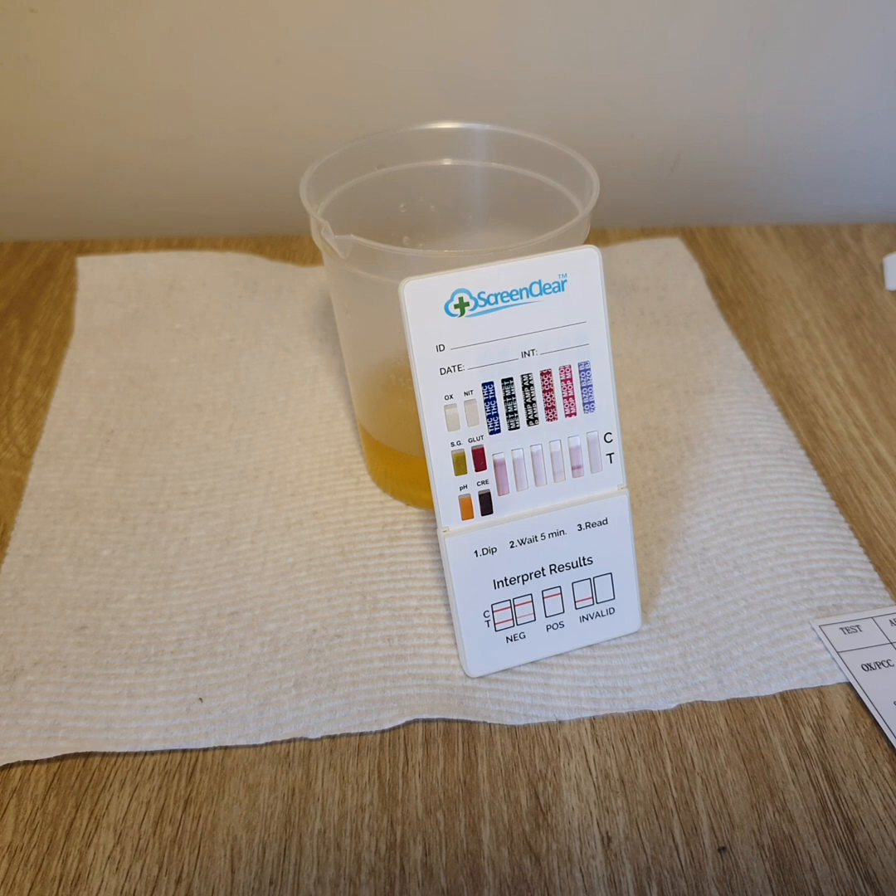This test is very popular in Australia because of its affordable nature when compared to a urine test cup. We supply these tests to a lot of different medical centres around Australia and businesses, as they are certified to Australian standard 4308.